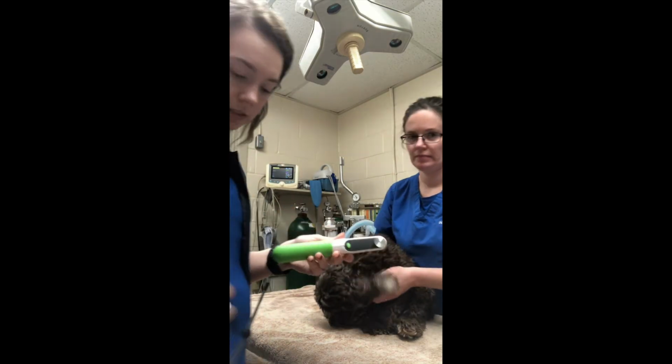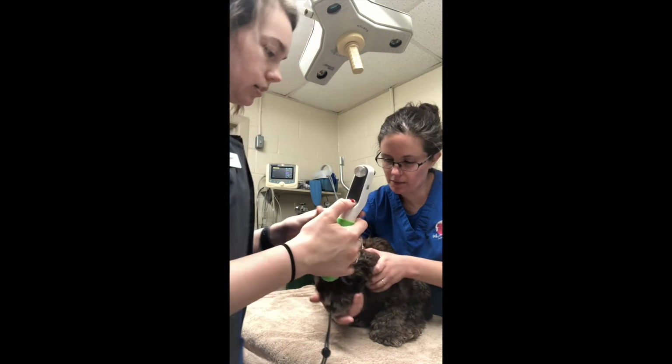Okay, and hers averaged about 19 on the right eye. Okay, and then we're going to do the left one.